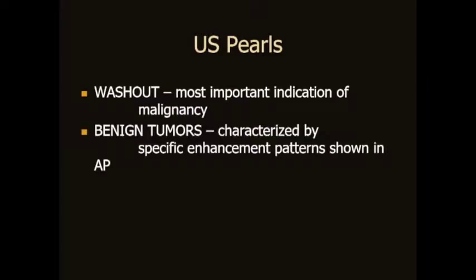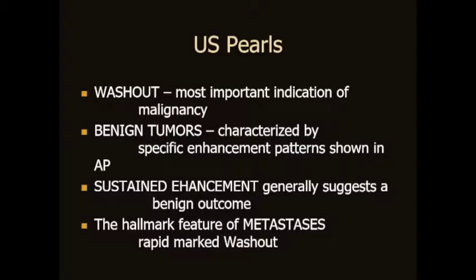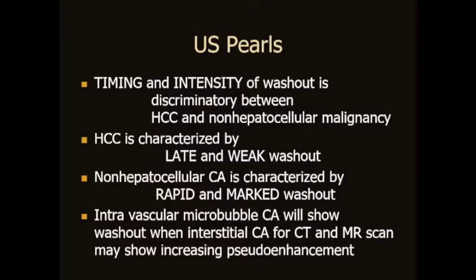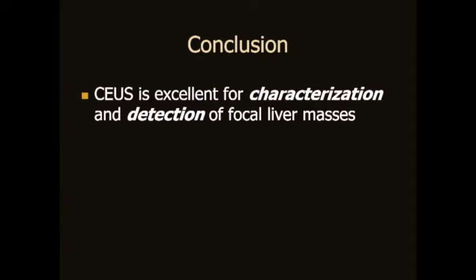Now, the ultrasound pearls that I've shown you are all reproduced in my syllabus, and if you're interested, they're there, and I'm just going through them right here. And so in the interest of time, I won't repeat them, but I believe if you understand all of those things, you'll do exemplary. Peter Burns and I made a mistake on everything when we were starting, trying to work out all of these rules. And so I hope that my sharing them with you will be helpful.